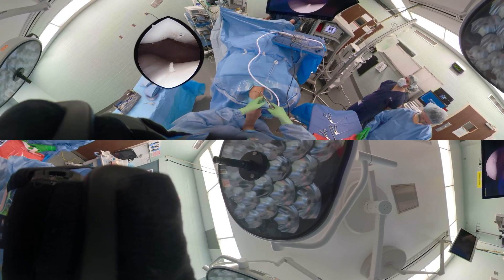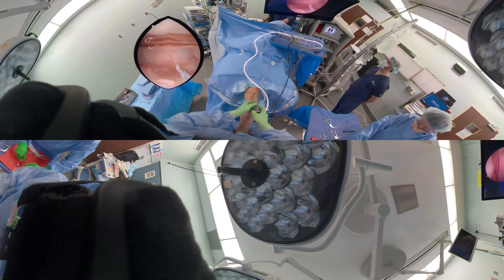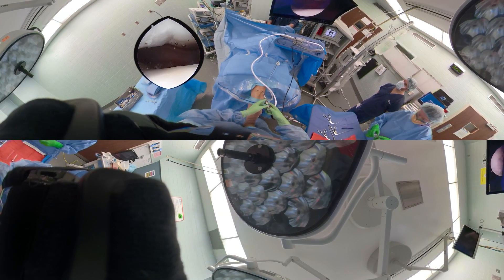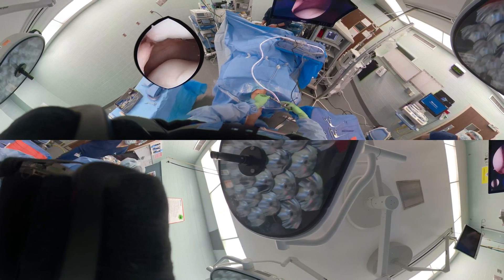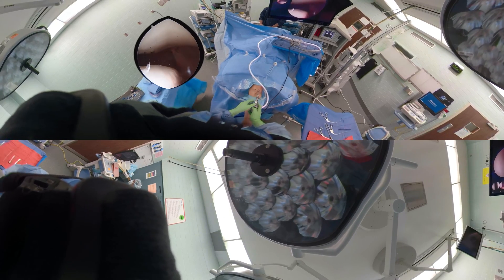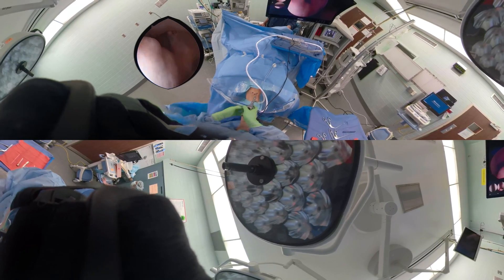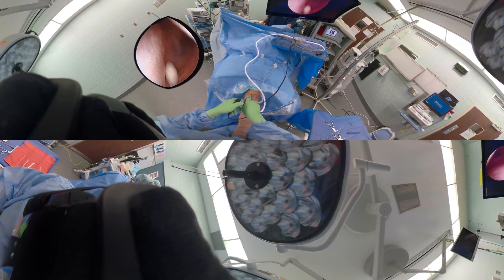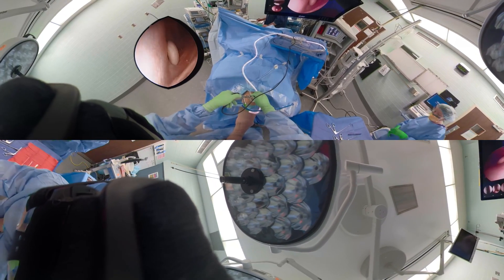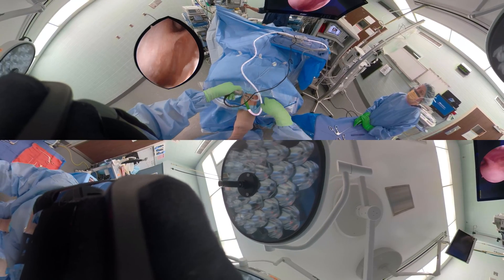Now you can see the undersurface of the patella and the trochlear groove. This patient has a loose body from a patellar dislocation that occurred three or four years previously — she could feel it pinging around. We know on the x-ray she had a loose body in the lateral gutter, and looking into the lateral gutter, there's the loose body.